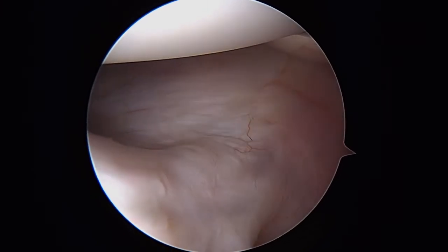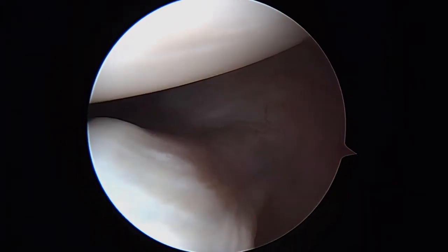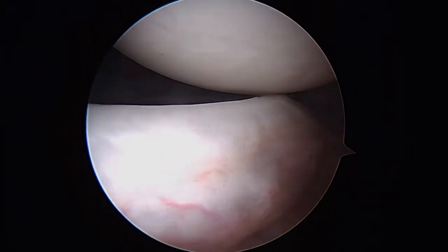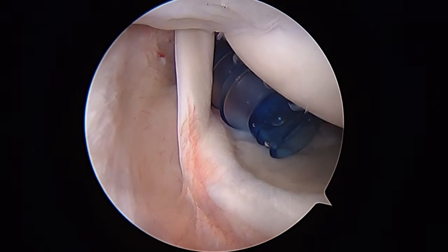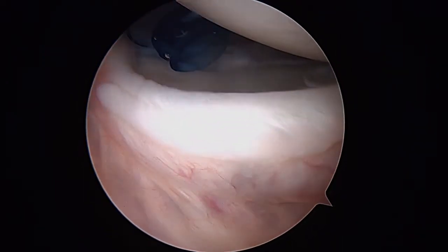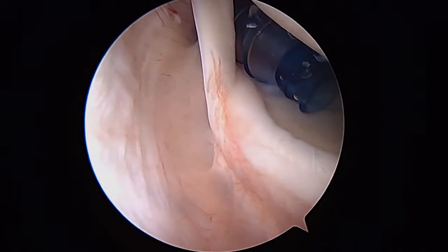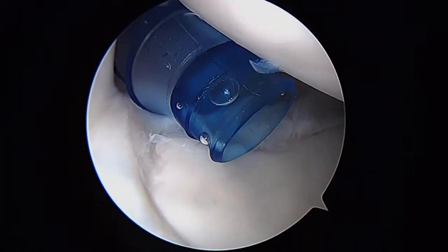Here's the back of your shoulder. You can see this posterior band of the inferior glenohumeral ligament is pretty lax. And as we pull back, we can see that your glenoid looks like an island there — it's just sitting out there in the open. That's really a tip-off that there's ligamentous laxity in the shoulder. When you can see the entire glenoid, you can see the capsular insertion is very medial here. This is what a shoulder looks like that is at risk for being unstable.